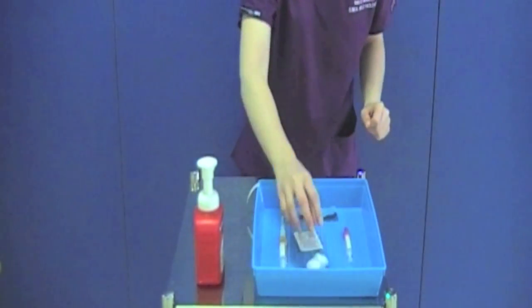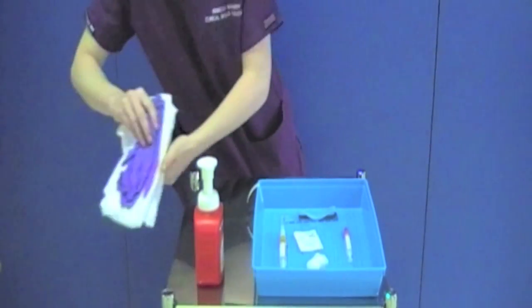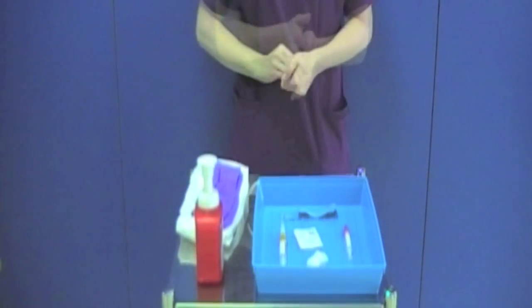Place your apron and gloves onto the clean trolley. Decontaminate your hands and proceed directly to your patient.